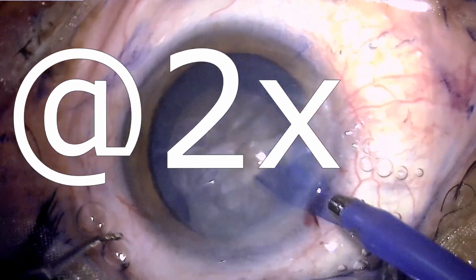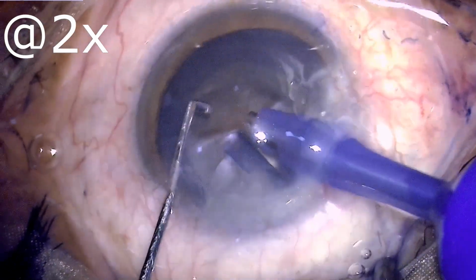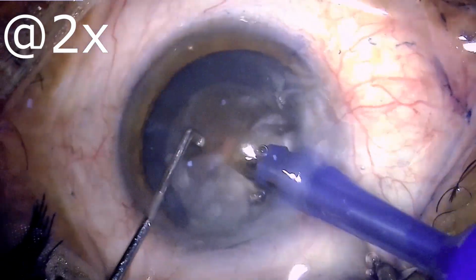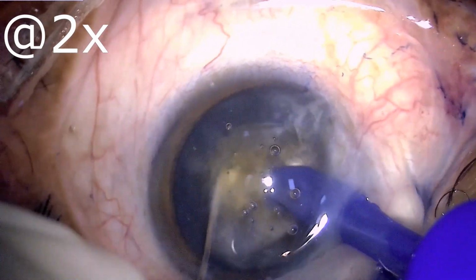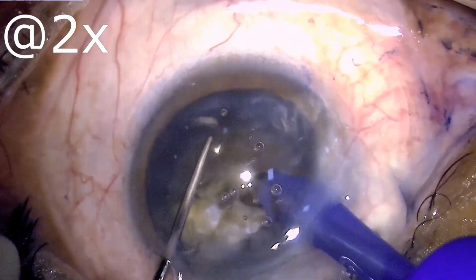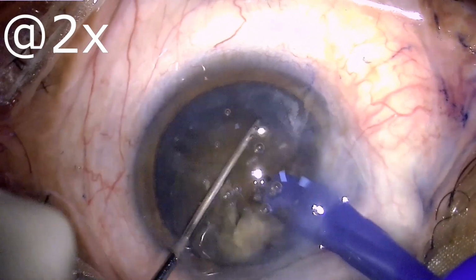So now this was a point where I had to think whether I should proceed with phaco or switch to manual small incision cataract surgery, which might have been safer. But then I decided for phacoemulsification, and using the burst mode, I buried deep into the nucleus and tried to create a primary horizontal chop. And this was not a complete chop, but then the second one gave me an edge, and the surgery could be proceeded.